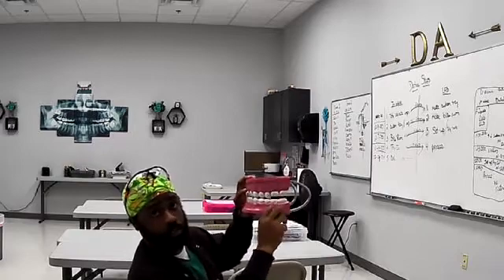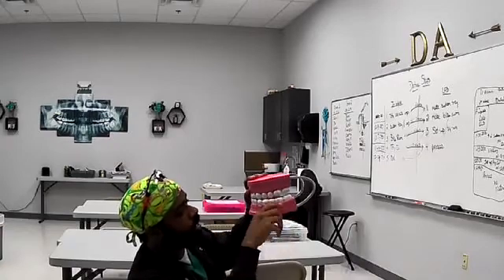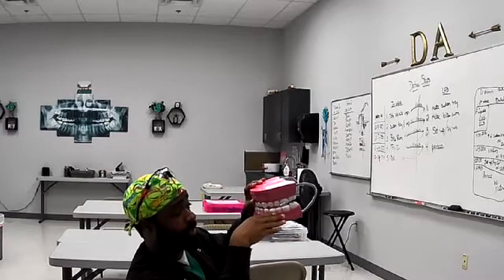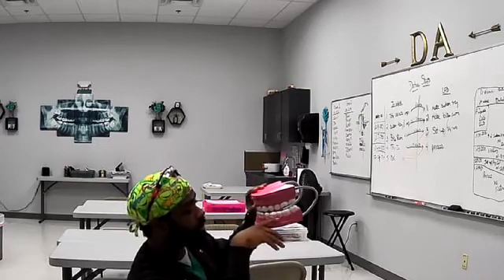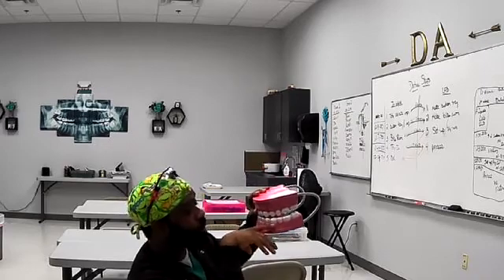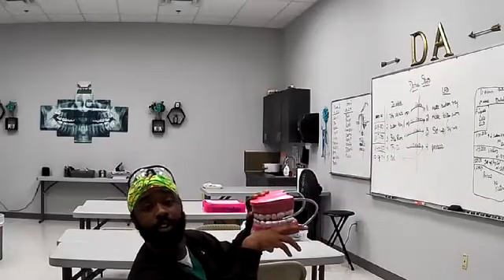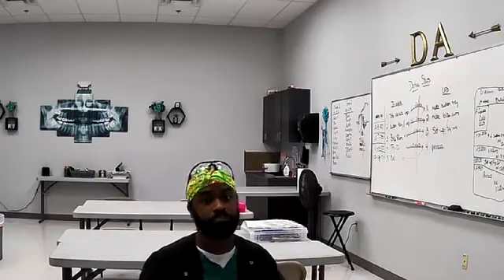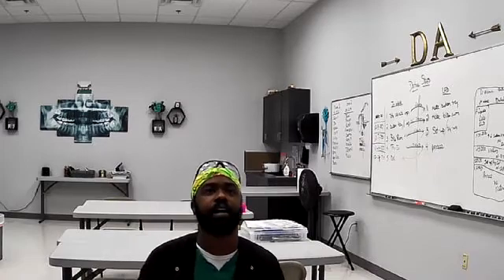So if this tooth is badly decayed and you take a bite wing, the line will go straight, and then it will just dip down. It might not be a severe dip. Some are very prominent, but some could be just a slight dip. But you need to realize stuff like that. It might go straight, like the normal arch, then just the slightest little dip, and then go back straight. Okay? If you see that, you can say, hey, we might want to take a PA of that area to see what else is going on. But we'll get to that.